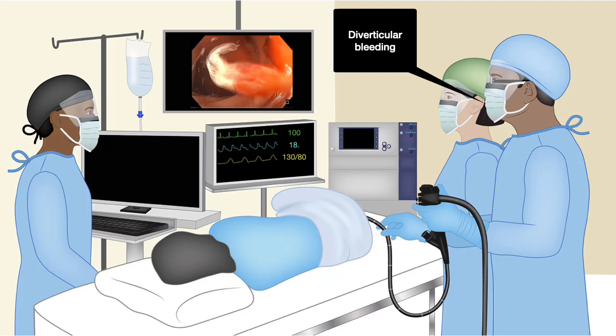So let us talk about endoscopic management of diverticular bleeding and also look at other options for managing diverticular bleeding. So here we performed an endoscopy after stabilizing the patient, clearing the colon, and we notice some blood here close to a diverticular orifice. And let us learn about the diverticular bleeding.